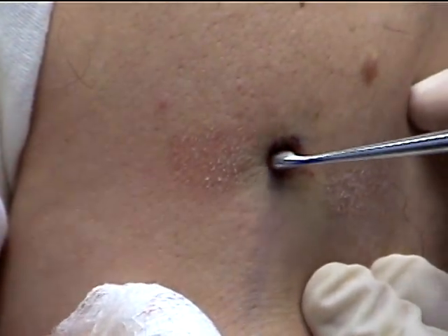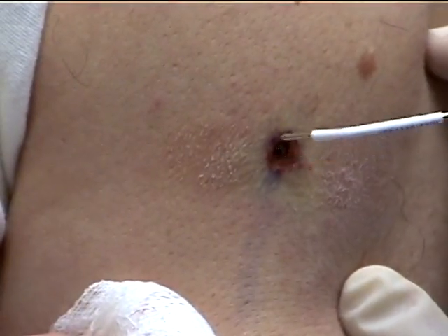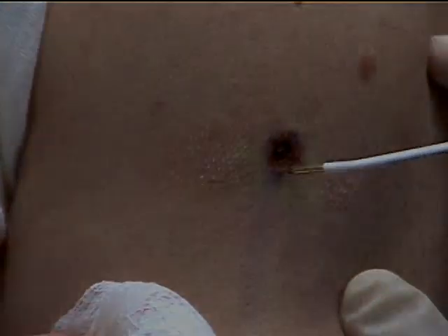Cover the wound with a simple adhesive bandage upon completion of the procedure. Cure is assured by finding normal skin on follow-up examination.